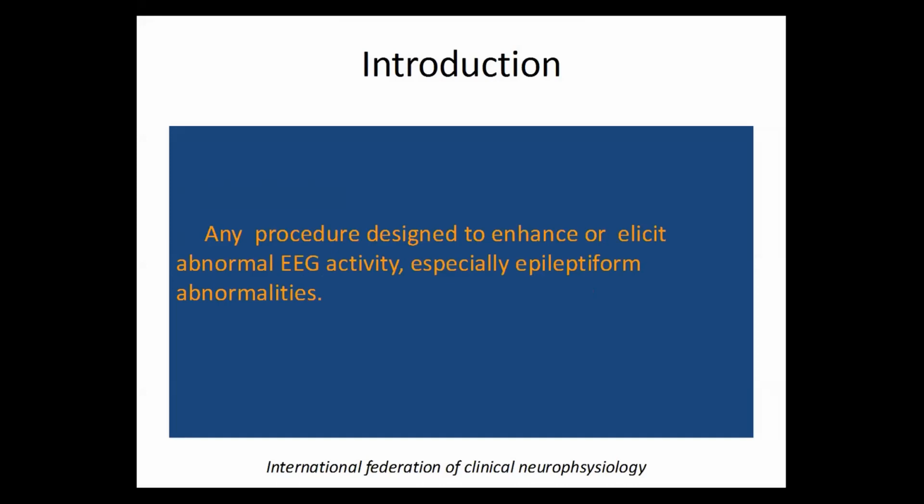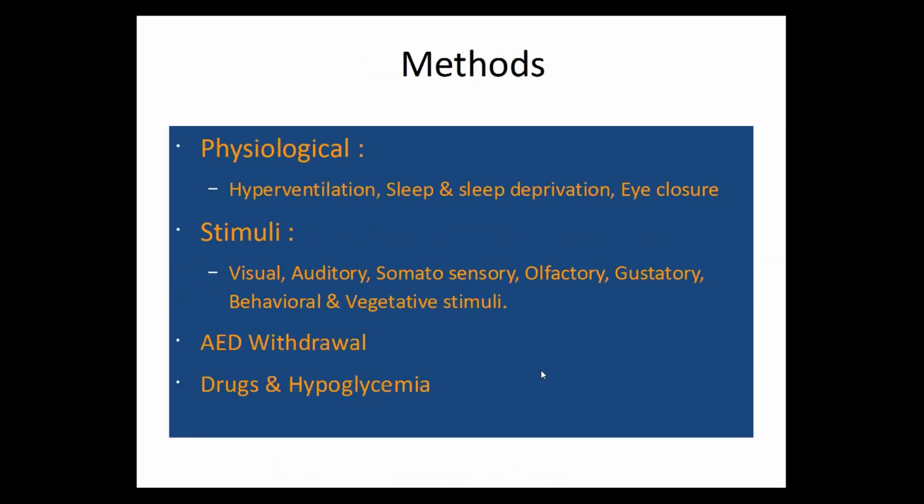If you simply do an EEG, you may not get the abnormality, so we have to do these procedures to get it. You are activating the occurrence of epileptiform abnormalities, so they are known as activation procedures.